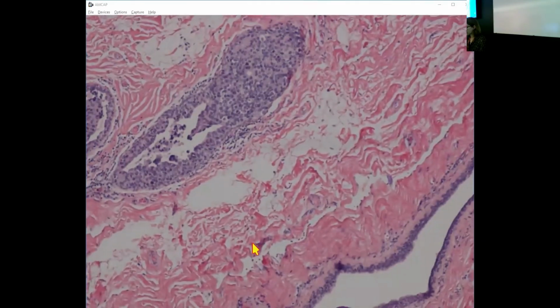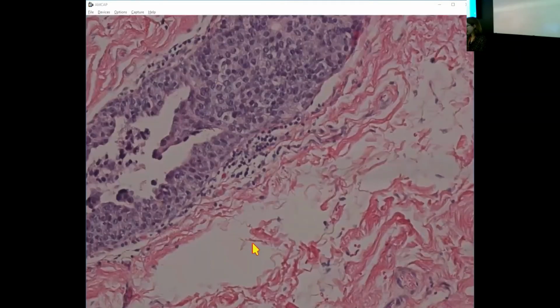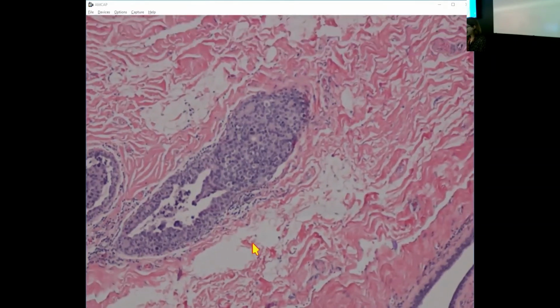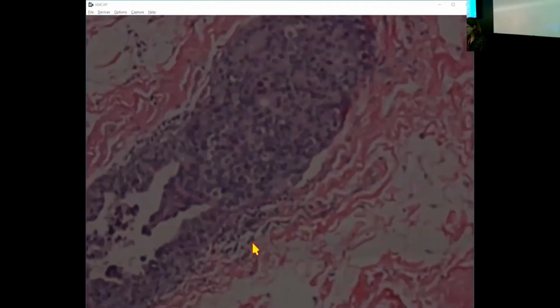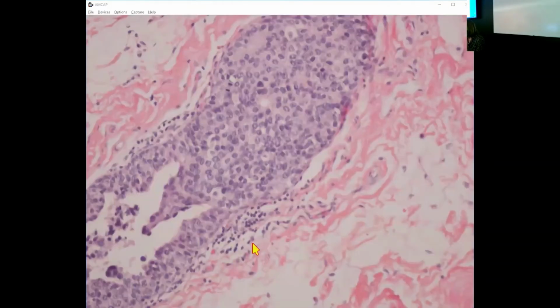here is my sort of intermediate grade DCIS versus UDH challenge. And these are the ones that I think can be so difficult. I don't know, this is my biggest struggle. Is it you, or you think it's easy? First, I think the differential here is UDH versus intermediate grade DCIS.